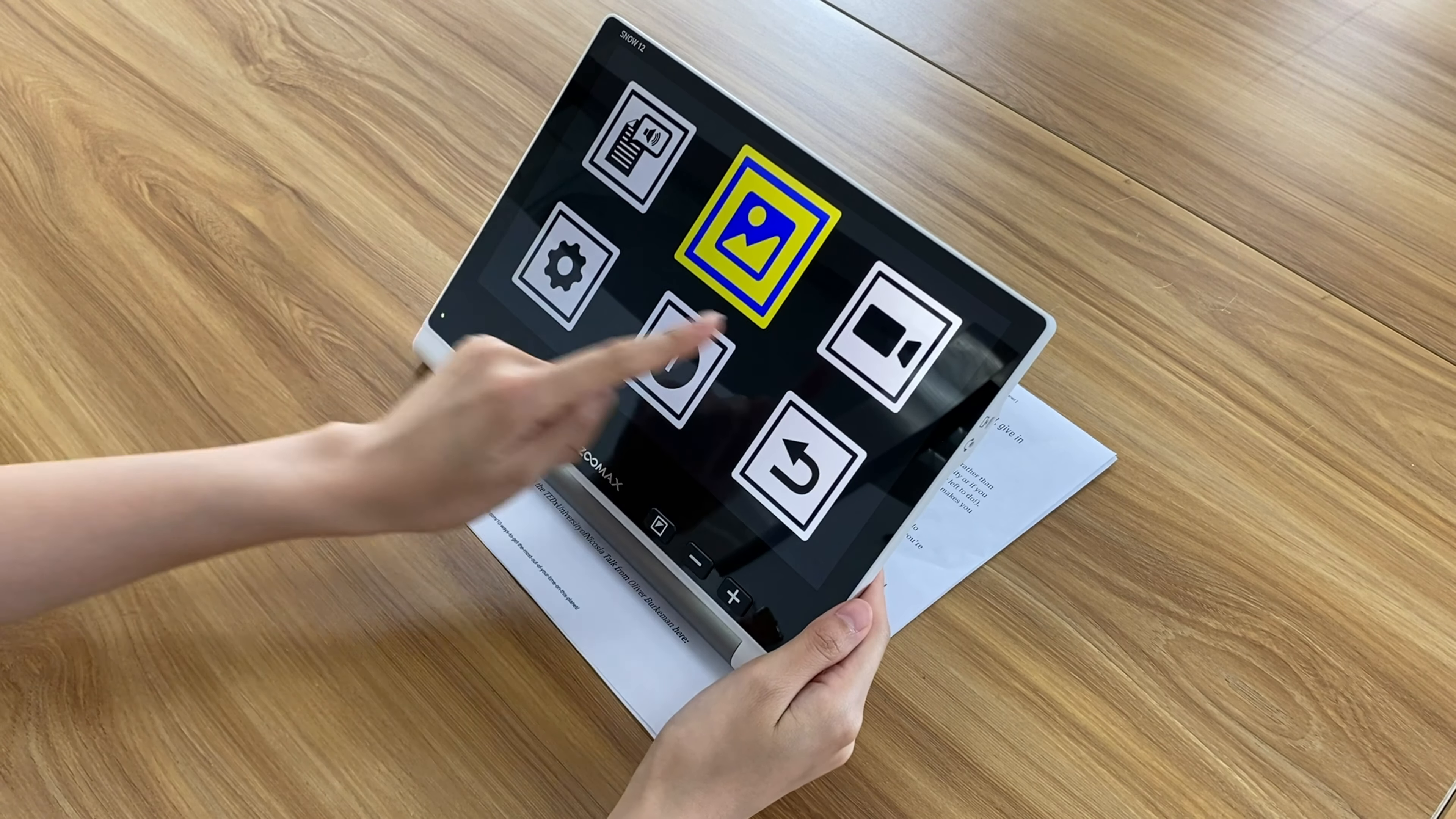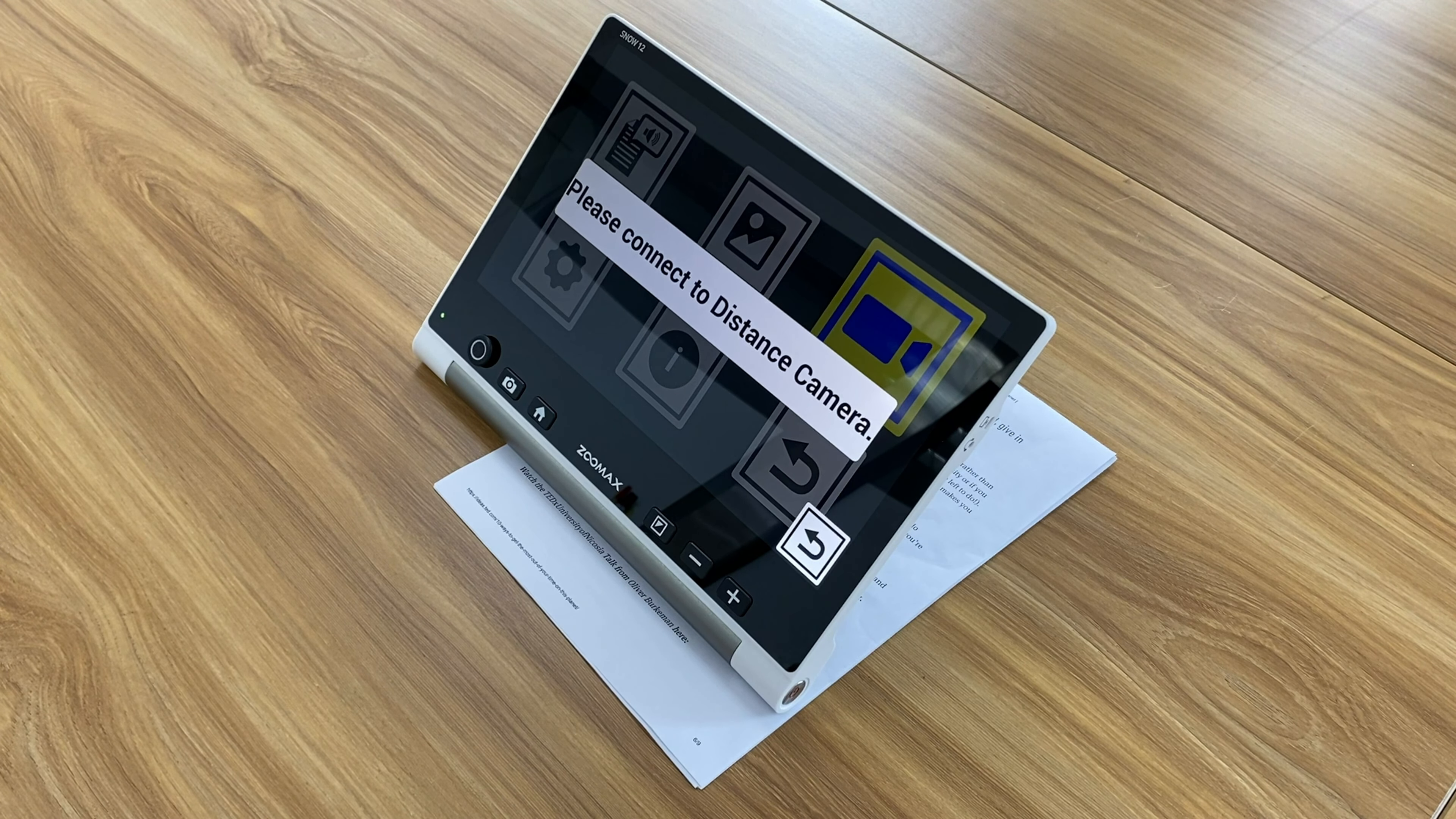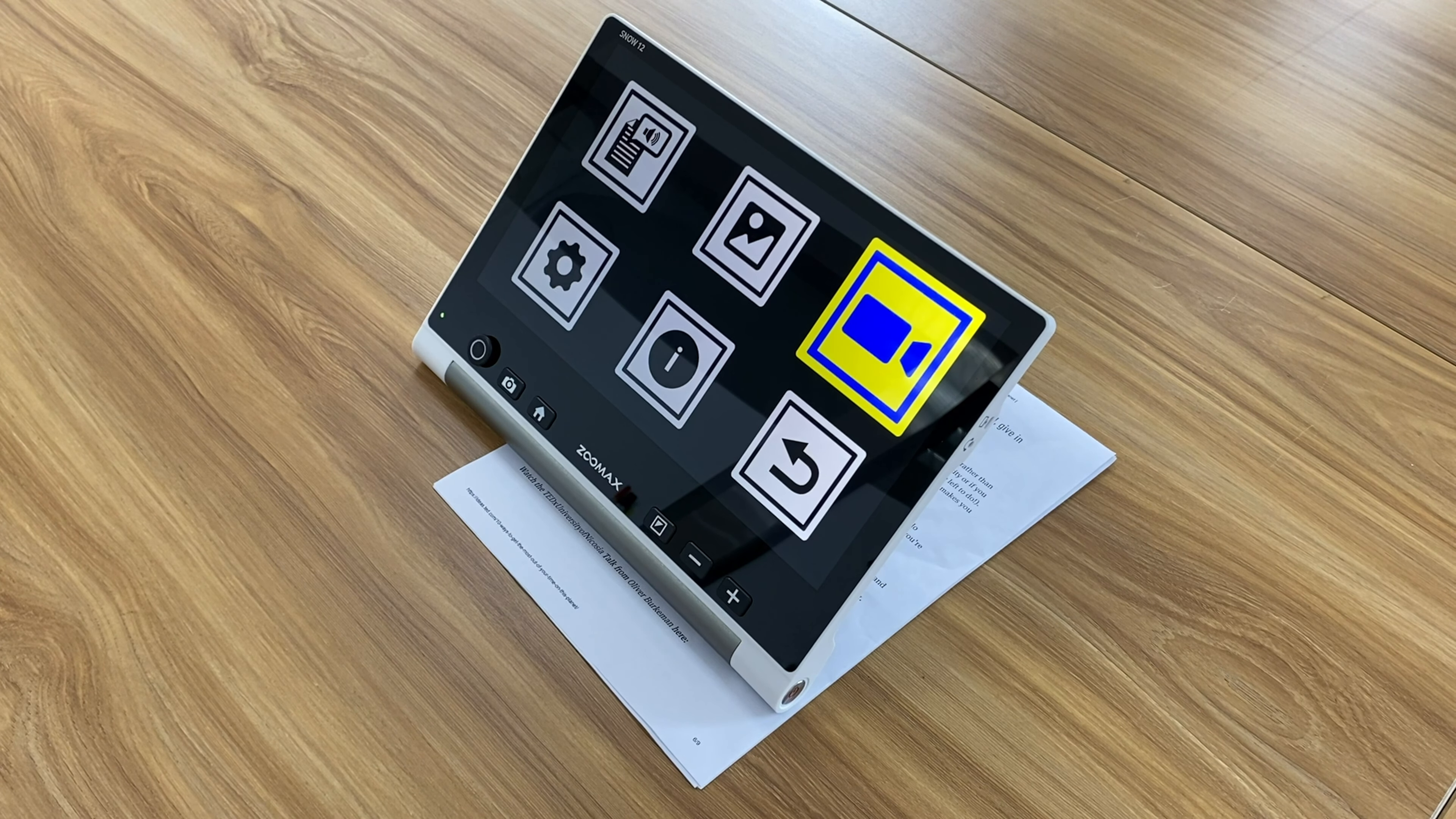Let's move to the external camera icon. Here you will enter distance view mode when you connect the device to our equipped external distance camera. The external camera can help you see things from a distance clearly. We are updating the camera currently and will offer it again soon. Please keep an eye on our follow-up product updates.